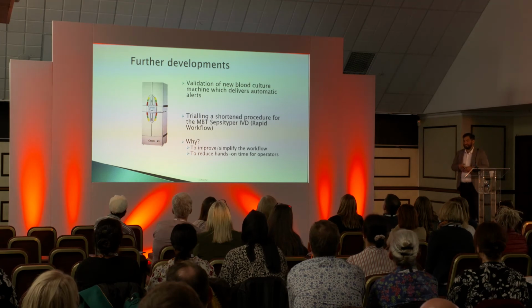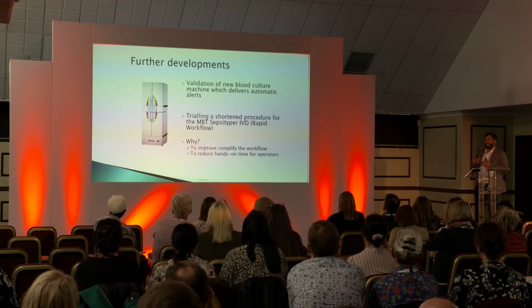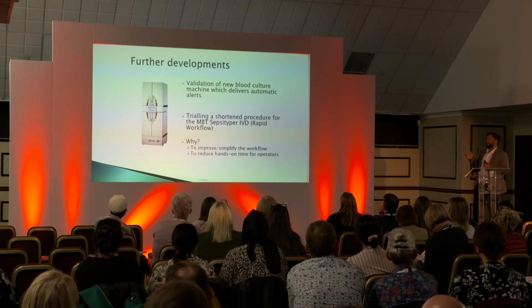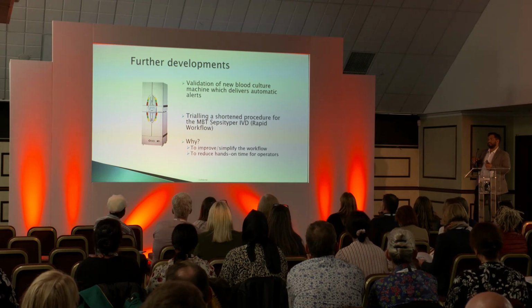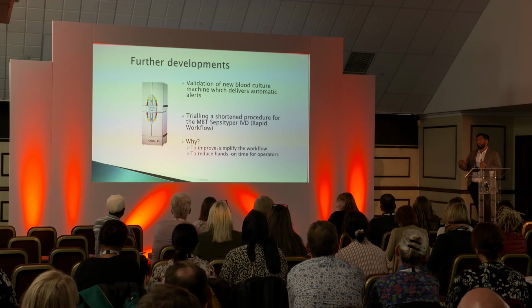Okay, so further development. Obviously, introducing MALDI-TOF and introducing Sepsityper were really big changes to our laboratory, but we are always trying to drive to still improve. We got a new blood culture system, and while we were validating that for use, we also trialled a new rapid shortened procedure. For blood cultures that had flagged up positive, following the Sepsityper method, we removed a step just to reduce it even further. And again, it's to simplify the workload for the laboratory.